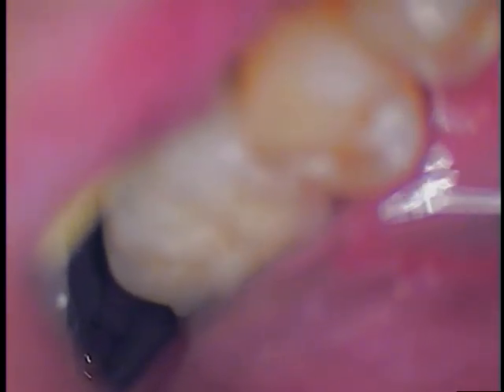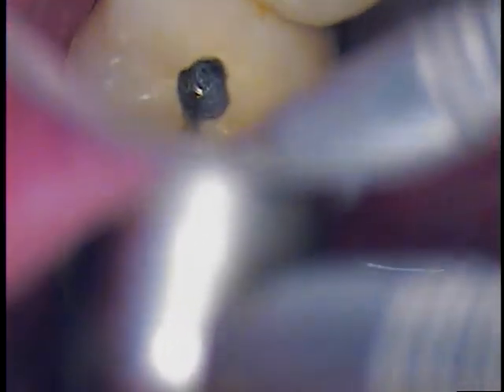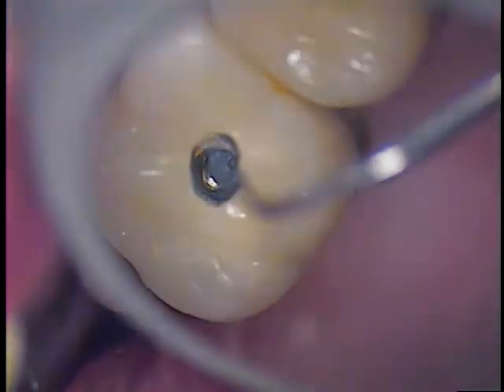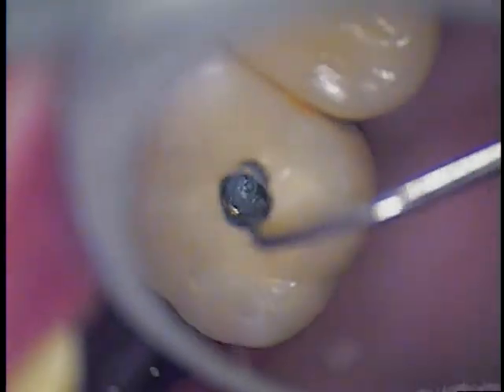So I'm going to go back to the 330 burr, and again I'm going to take the water off. At this point we'll just use air and it's just slow RPMs. As we progress we're just going to see if it penetrates into the head of the screw and find out where that is.